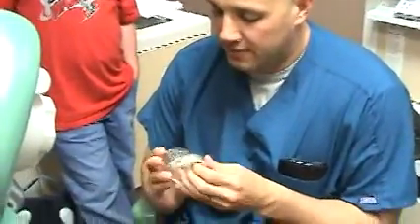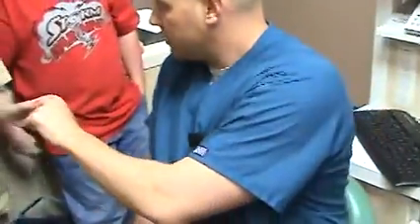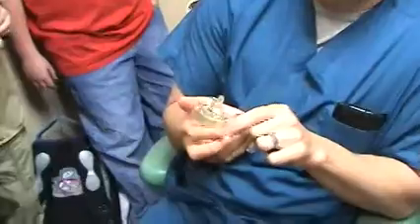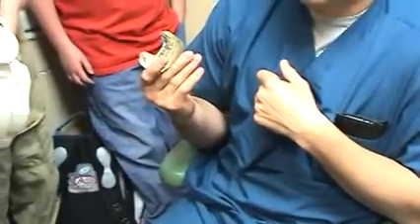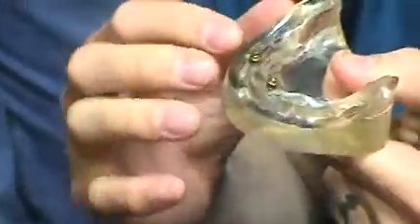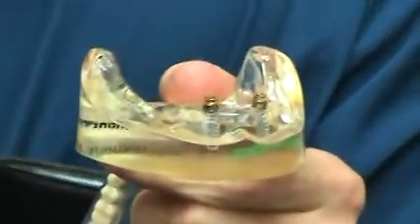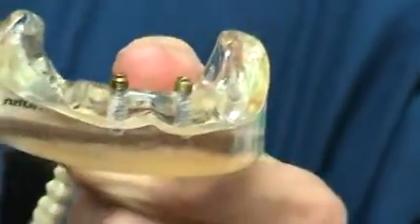All right, so here's a model which is depicting an implant. Remember we were talking about implants and implant overdentures? That's what this is. This is depicting 2 implants into the lower jaw. You guys see that? Looks like 2 little screws threaded down into the bone. That's what it is. It's not a whole lot different than the screws that you'd place in a wall.